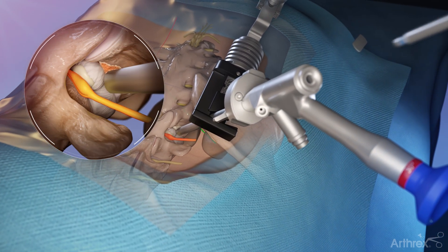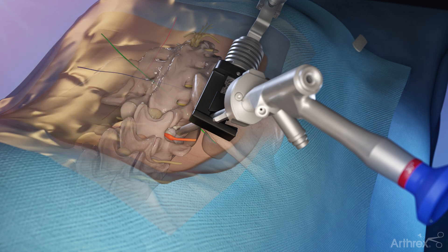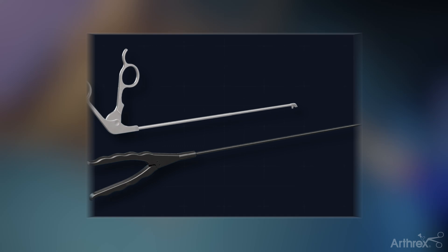Insert a series of endoscopic tools including graspers, the electrosurgery probe, and others through the working channel of the endoscope to remove excess tissue, coagulate blood vessels, and to provide visualization and access to the disc pathology.